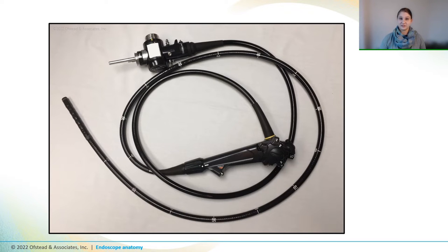Endoscopes are basically long, flexible tubes that have a camera on one end for seeing inside patients and channels for inserting instruments, flushing with water, or purging with air. This is an example of a GI scope, but you'll see the same basic components on a variety of scopes.